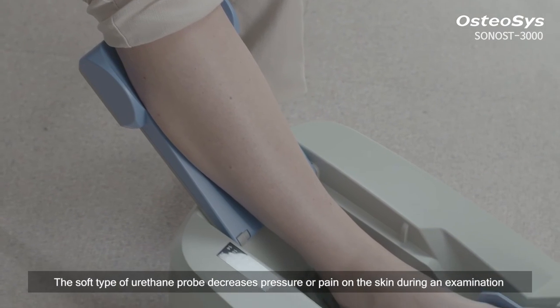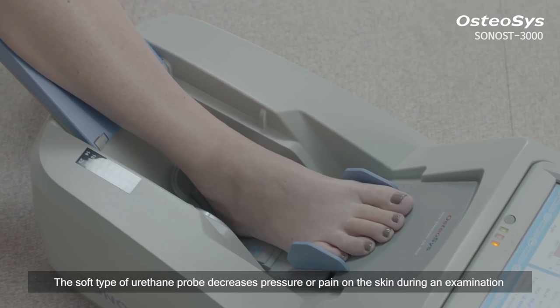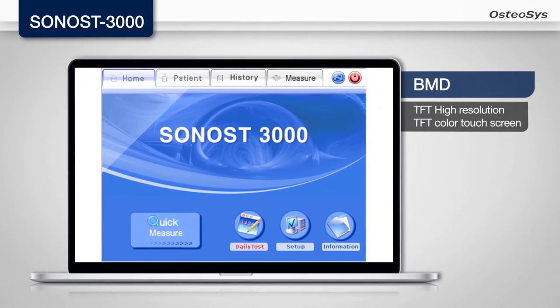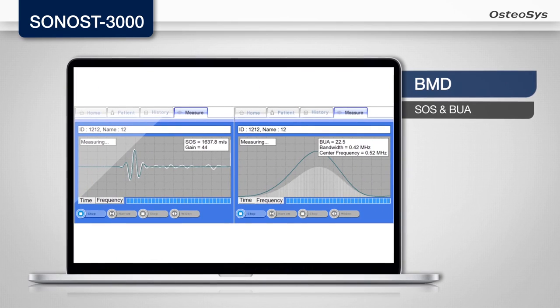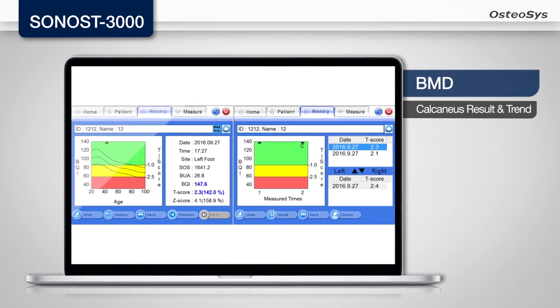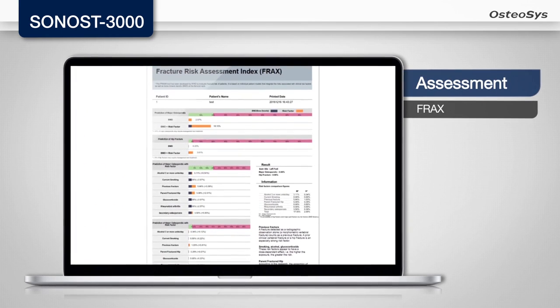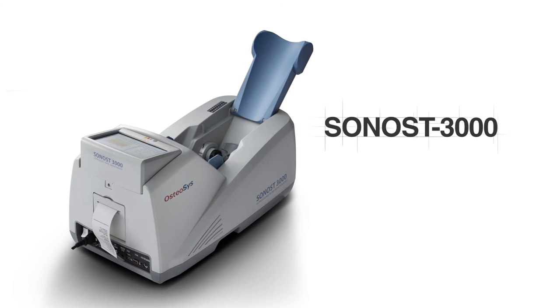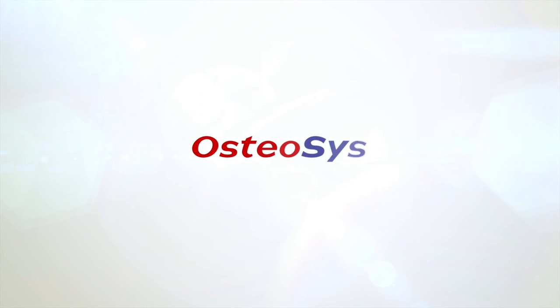The soft type of urethane probe decreases pressure or pain on the skin during an examination. Better products for better life. OsteoSys.